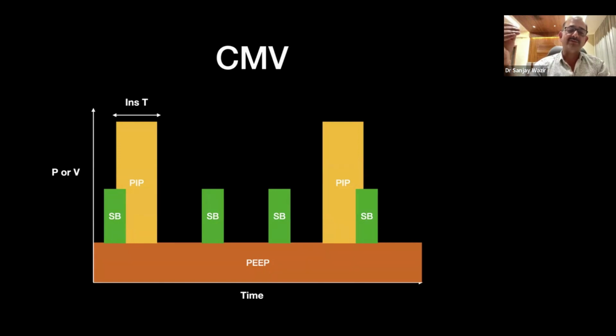But the problem with this is that sometimes the baby, like in the first case, is starting to breathe. It may have started early, and by the time it has reached the middle of its respiration, the ventilator starts breathing.